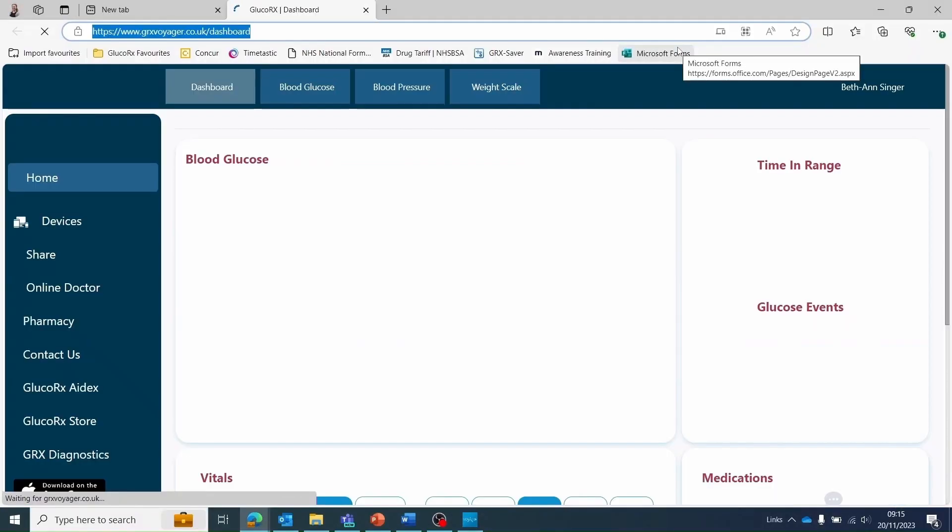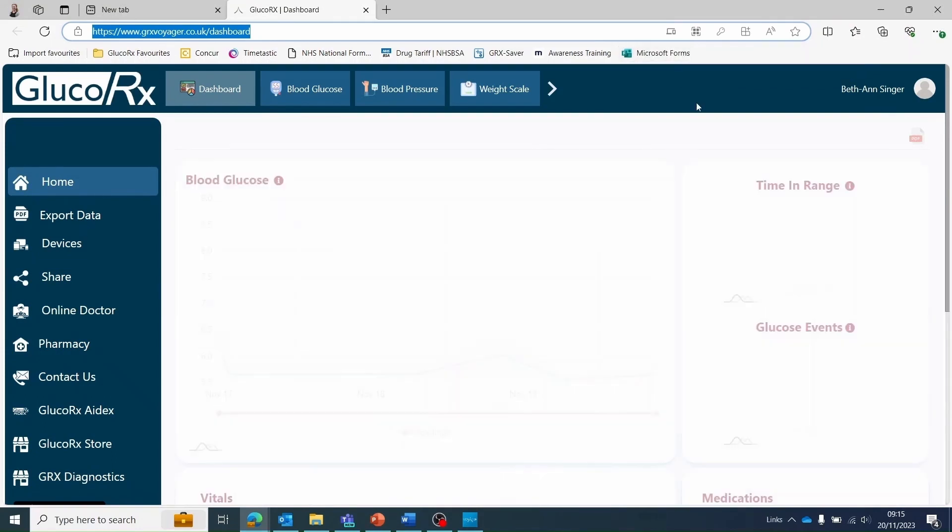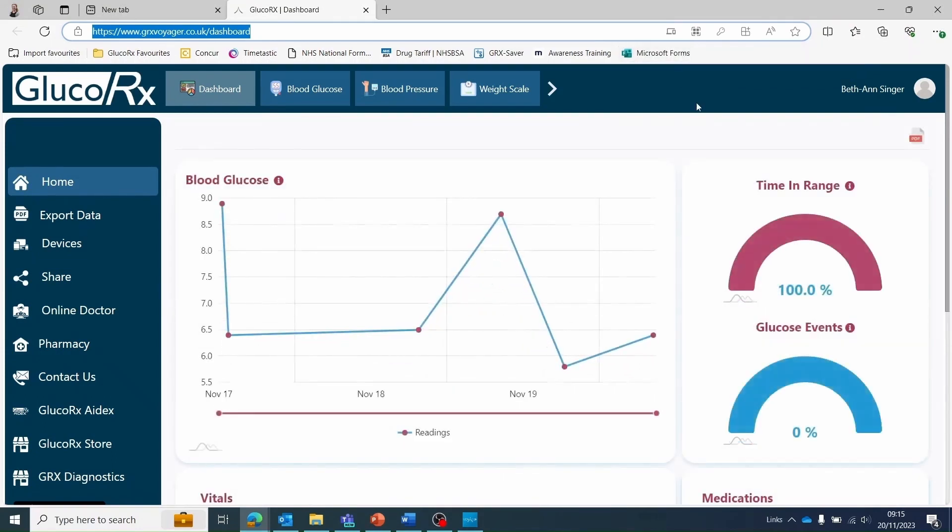GlucoRx Voyager will open automatically or you can manually open the dashboard by clicking visit portal. This will direct you to your homepage.